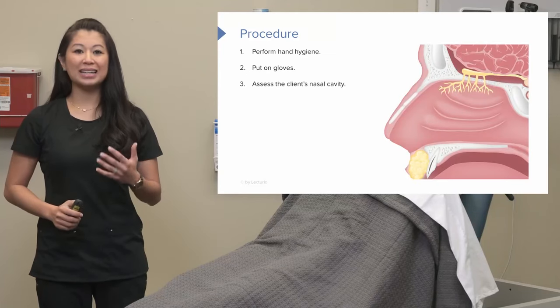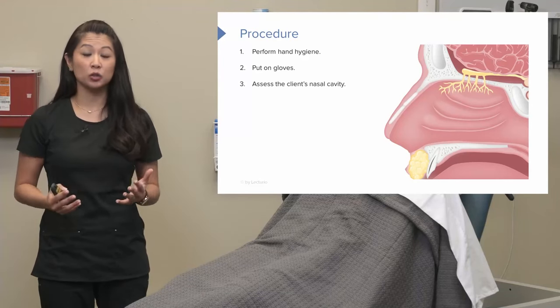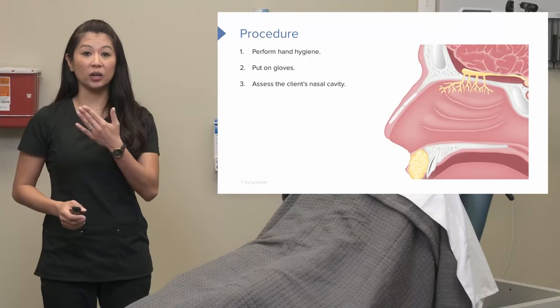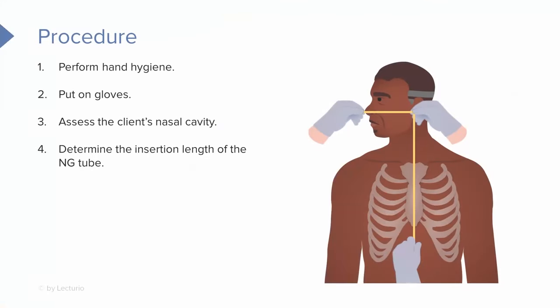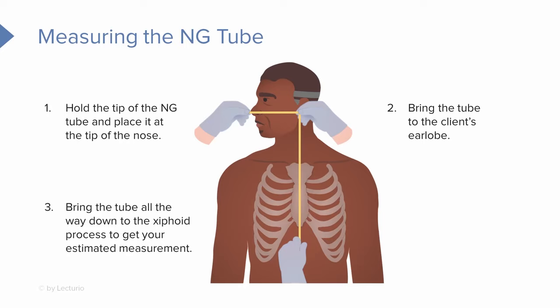It's really important to assess the client's nasal cavity, because maybe your patient has some facial trauma or a deviated septum. We want to look at each nare to see which one is best to attempt insertion. Then we've got to determine the insertion length: take the tip of the nasogastric tube to the tip of the patient's nose, stretch it across to their earlobe, and then all the way down to their xiphoid process. I usually go a few centimeters past the xiphoid process for safety.